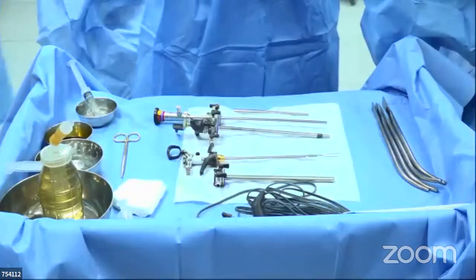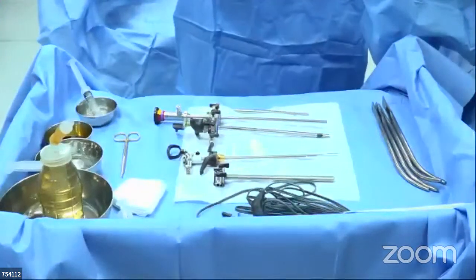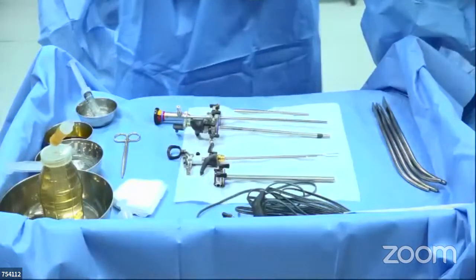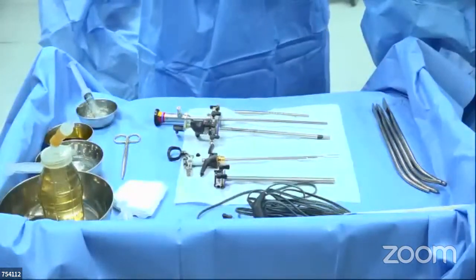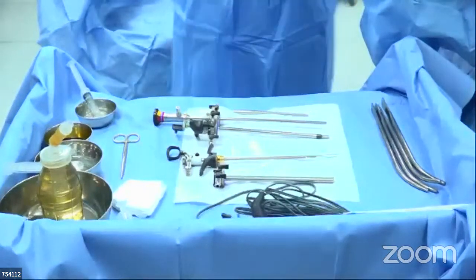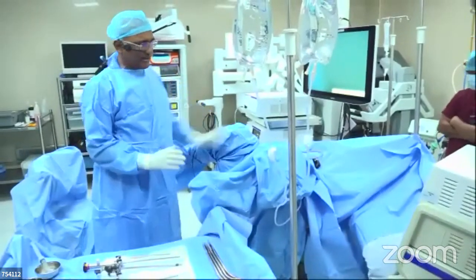If there is a definite stricture, we do an optical urethrotomy with a Sachse optical urethrotome, but not an Otis urethrotome as a routine, sir. Okay. So this is a lithotomy position, not an extended lithotomy like with stirrups.